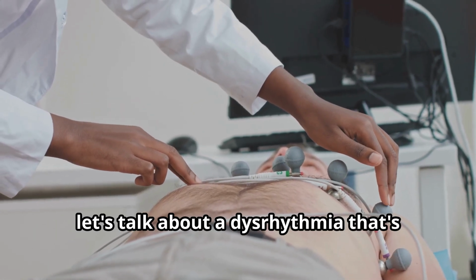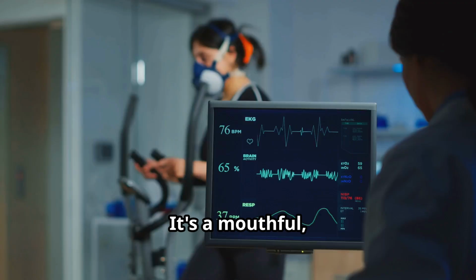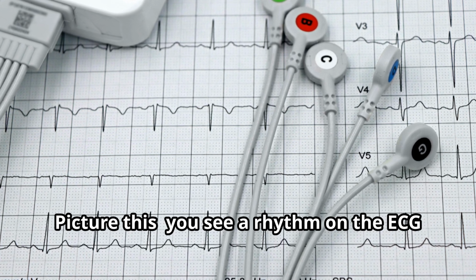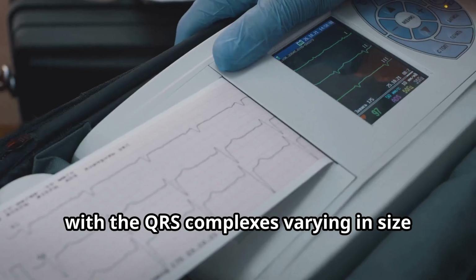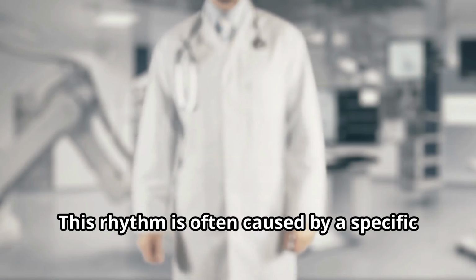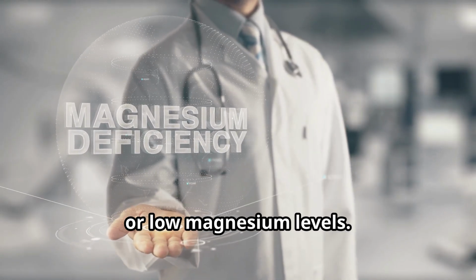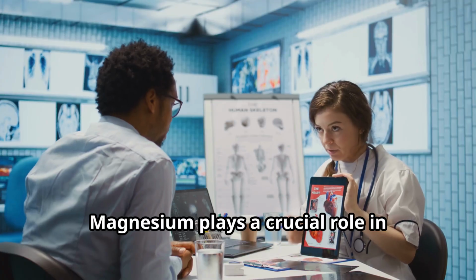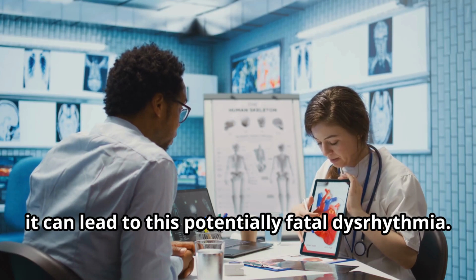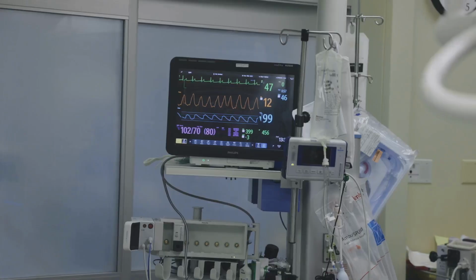Now let's talk about a dysrhythmia that's often linked to an electrolyte imbalance, torsades de pointes. It's a mouthful, but it's important. Picture this. You see a rhythm on the ECG that looks like a twisting ribbon, with the QRS complexes varying in size and direction. That's torsades de pointes. This rhythm is often caused by a specific electrolyte imbalance, hypomagnesemia, or low magnesium levels. Magnesium plays a crucial role in maintaining normal heart rhythm, and when levels are low it can lead to this potentially fatal dysrhythmia. So, if we see torsades, checking magnesium levels is key.